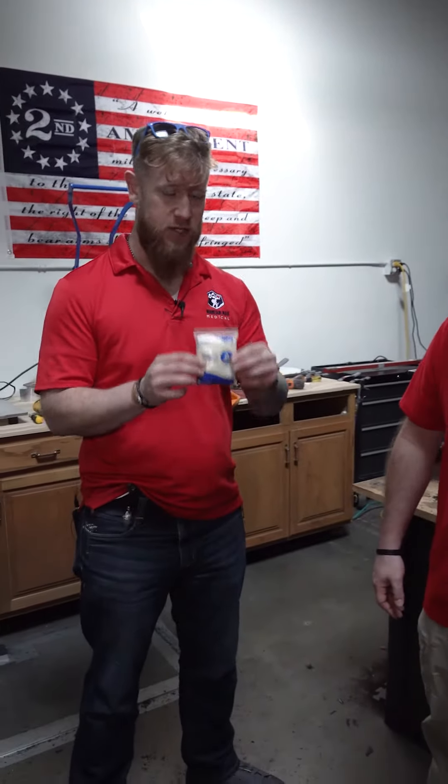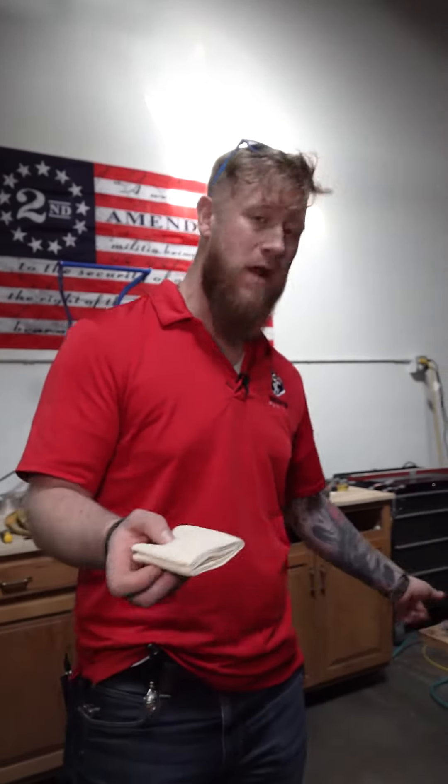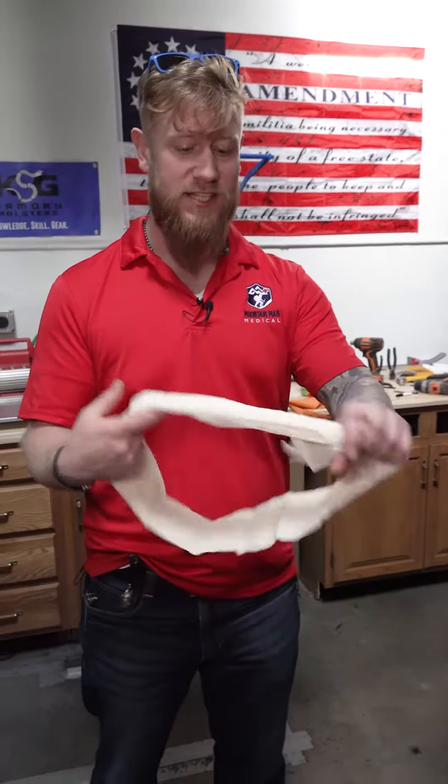This is a triangular bandage. Medics call this a cravat. It is another one of those multi-purpose items that you can use for a great variety of different things, including a makeshift tourniquet. Today, however, I'm going to show you how to use this as a sling.